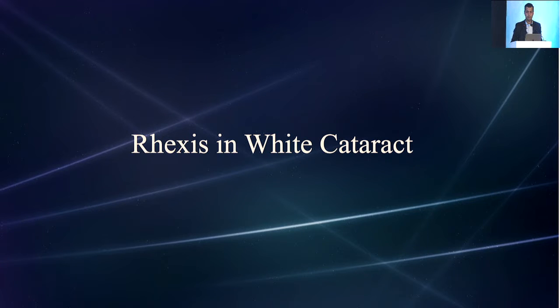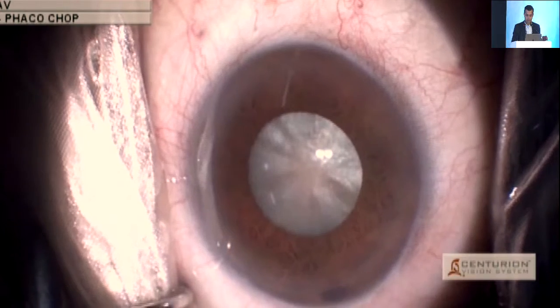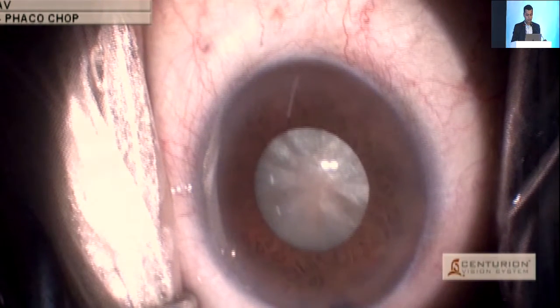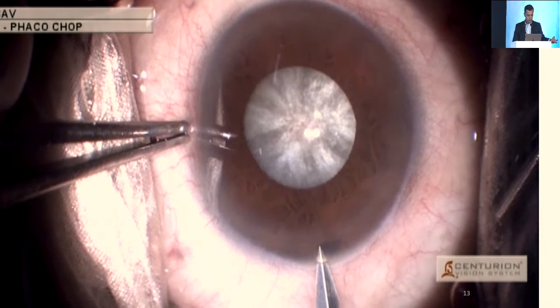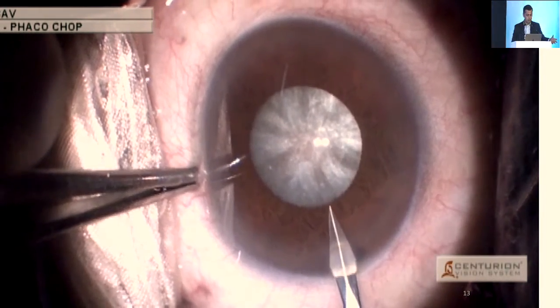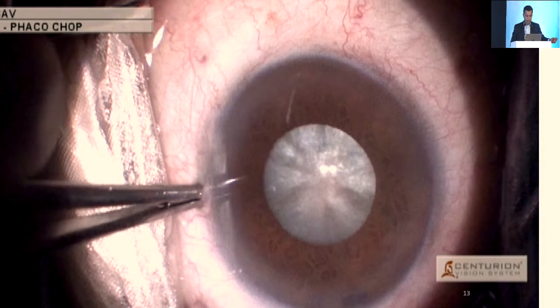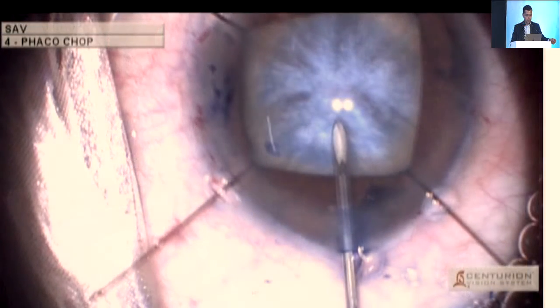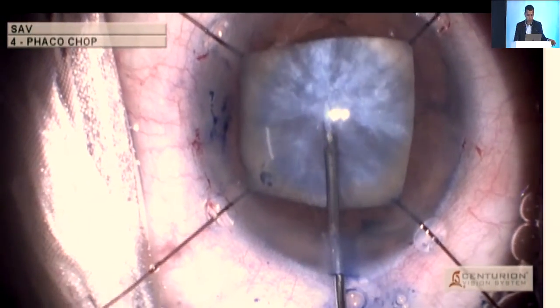White cataracts pose unique challenges, and all of us know the right challenge for white cataracts is an anterior capsule split. So I'm just going to show you what happens there. I normally use an even more cohesive viscoelastic or a viscoadaptive like Healon 5 if the lens is very intumescent. And I don't even make main incisions. I make a 1.2 millimeter MVR entry, and I use microrhexis forceps, so I don't make a big incision to let the viscoelastic run out.